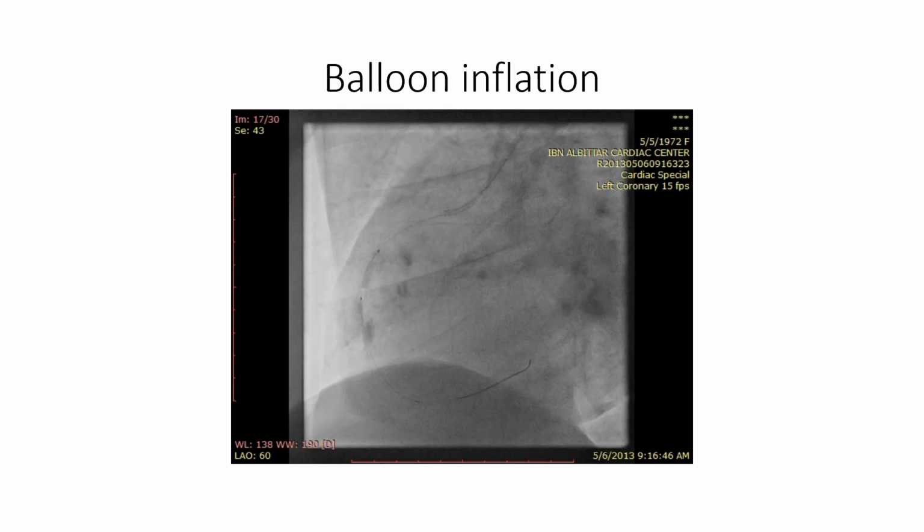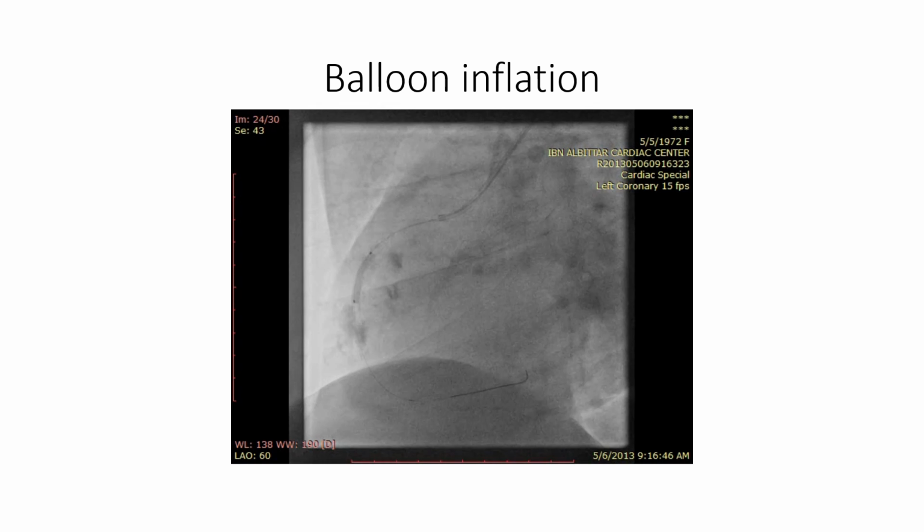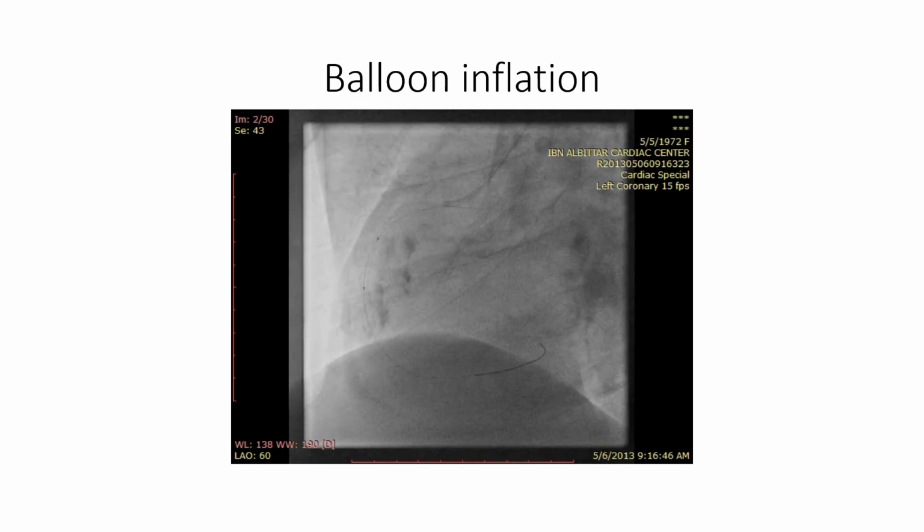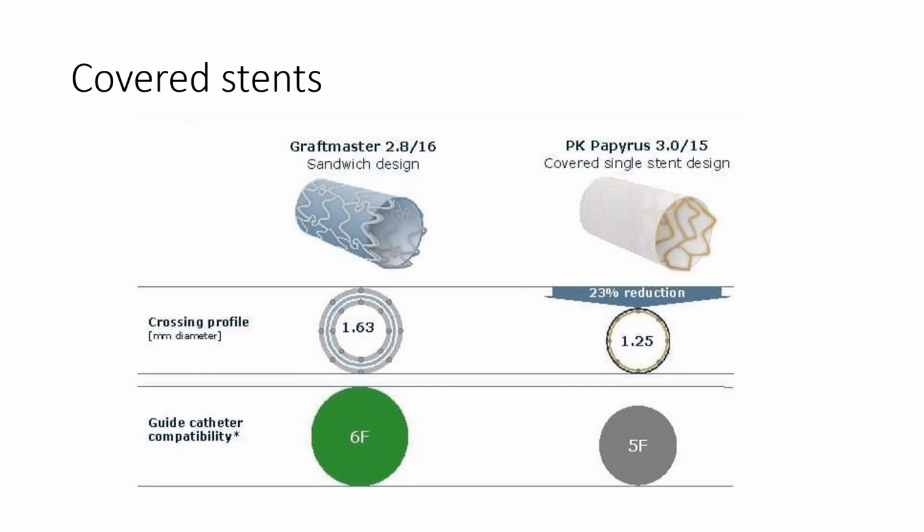So we did some balloon inflation for this patient, but the patient had severe chest pain and started to become hypotensive. So we prepared ourselves for a covered stent.